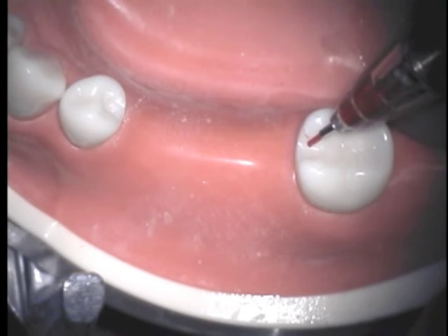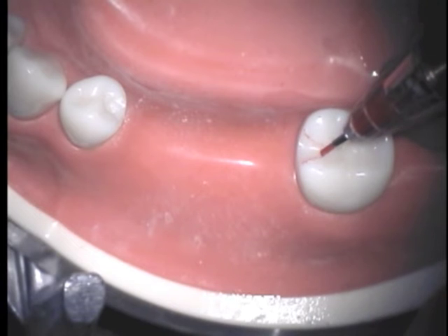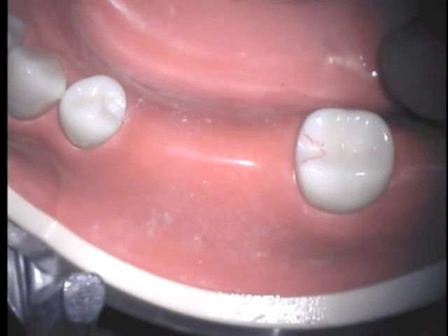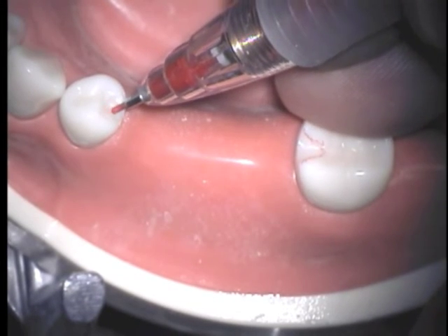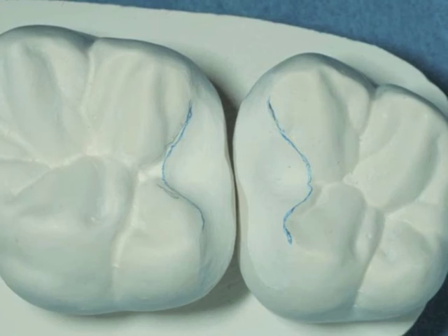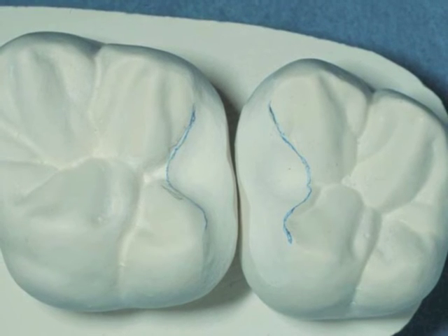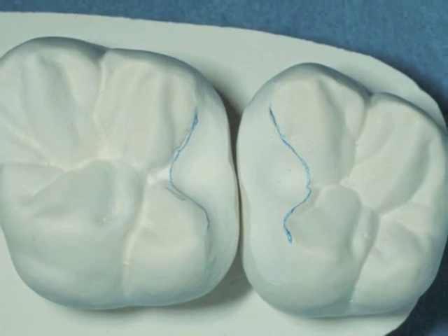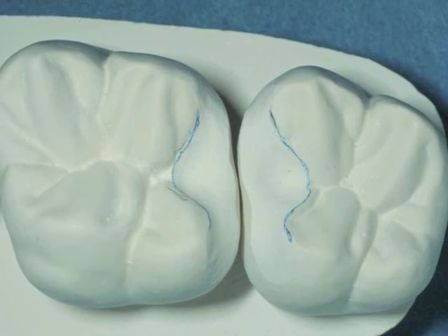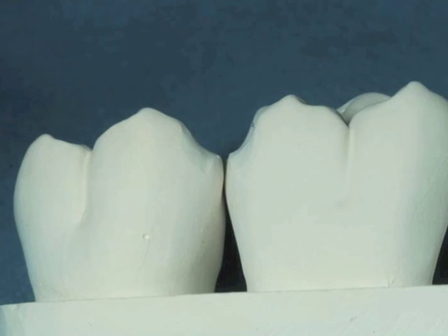When you're finished, your proximal occlusal rest seats should look like those outlined here with red pencil. There are variations in the shape of various occlusal rest seats, but the rounded triangular form, the deeper central preparation, and the reduction to create 1.5 mm clearance are common to all occlusal rest seats.